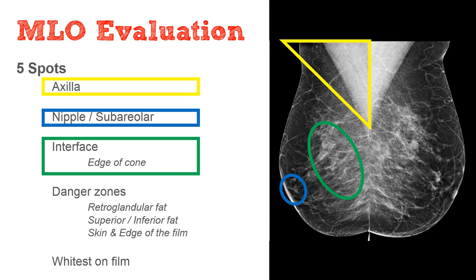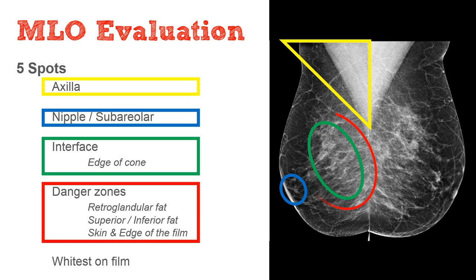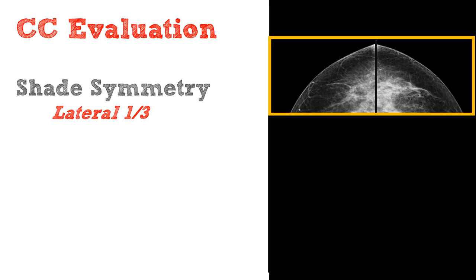Next, we're going to look a little closer at some danger zones. These are areas of fatty tissue where really nothing should occur. That includes the retroglandular fat, the fat superior and inferior to the glandular tissue, as well as taking a quick look around the skin and edge of the film for any abnormalities. And the final step of evaluating the MLO view is to look for the whitest, brightest thing on the film. This is just a little trick, but it's amazing how often cancers will appear as the brightest thing on the film.